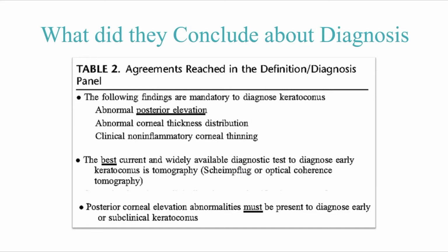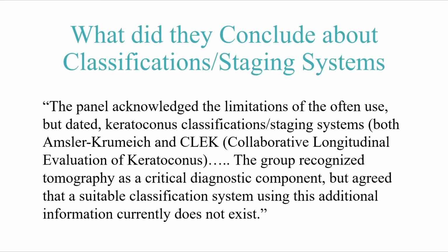They also stated that the best current and widely available diagnostic test to diagnose early disease is tomography, be that either Scheimpflug or OCT. And they went further and stated that posterior corneal elevation abnormalities must be present to diagnose early or subclinical disease. Well, what did they conclude about classifications or staging?